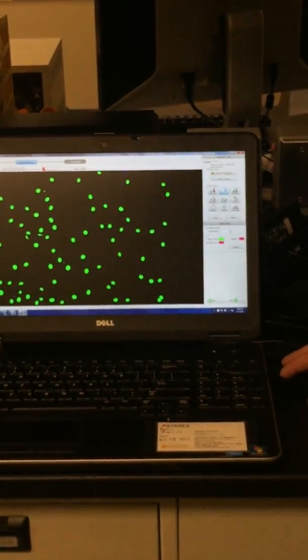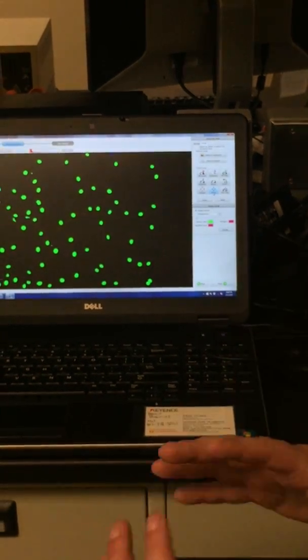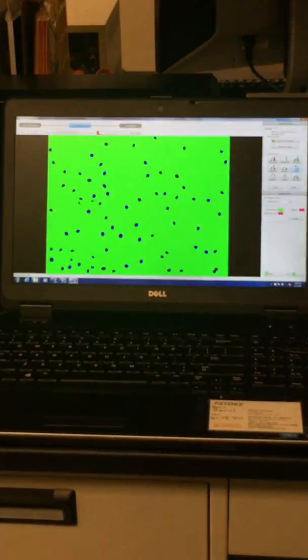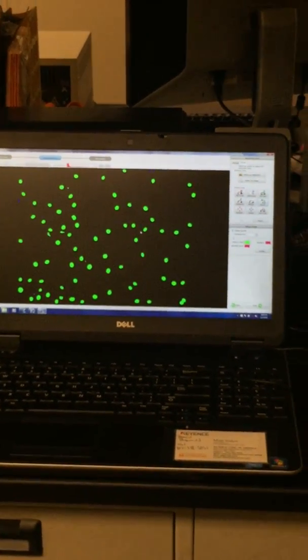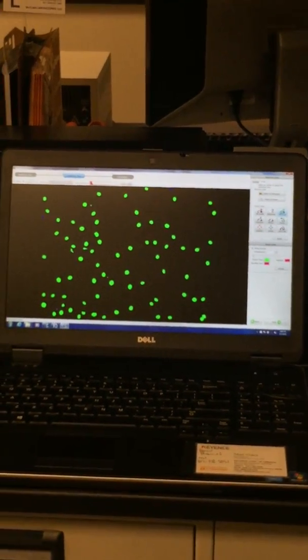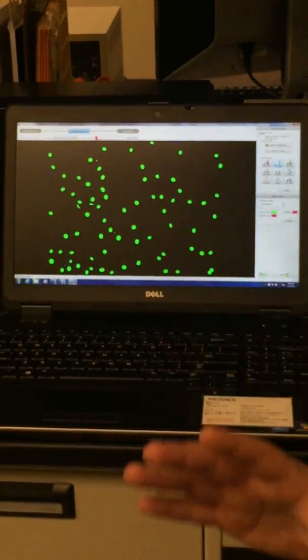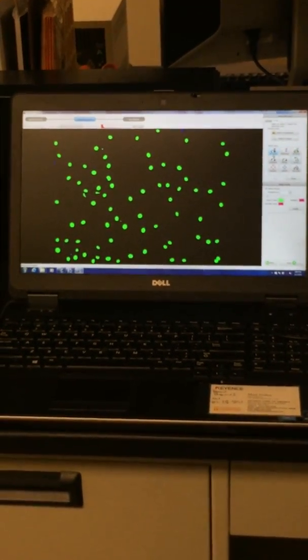If you go to the details tab, feel free to click through all of these and see what they do. Expanding and shrinking, I'm sure you can guess what that does. Inverting: let's say I wanted to count the space in between the nuclei that I didn't really care for, you can do that. Fill holes: if it's not filling in the entire tissue, but you know that's part of the tissue that's being surrounded, fill holes will take care of that. Deburring right here: if you have all these little scattered pixels that you don't want to count, you can adjust that and get rid of them by certain levels. Fill cracks is like filling holes, but it's filling cracks.